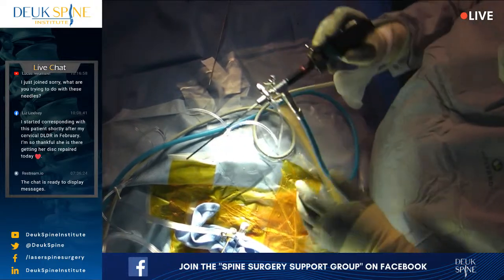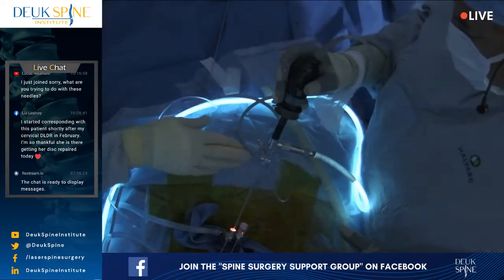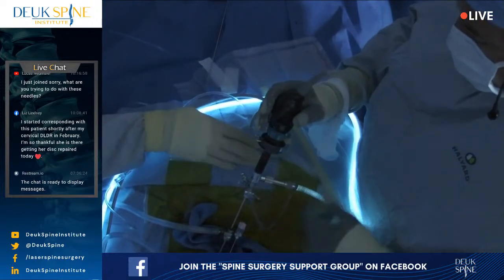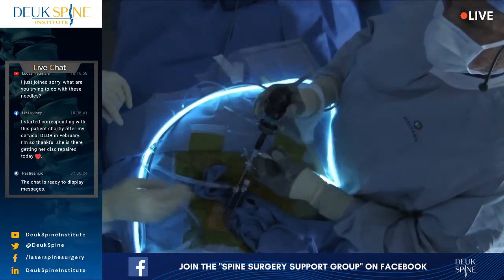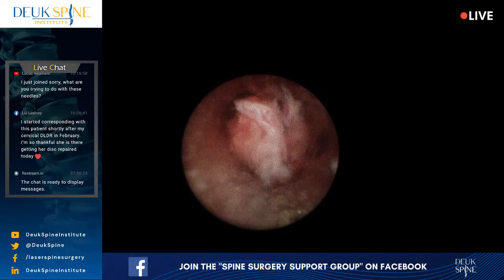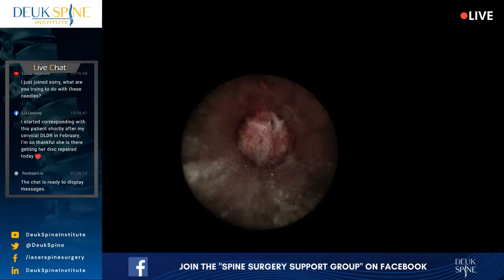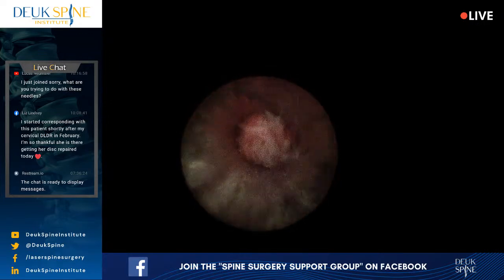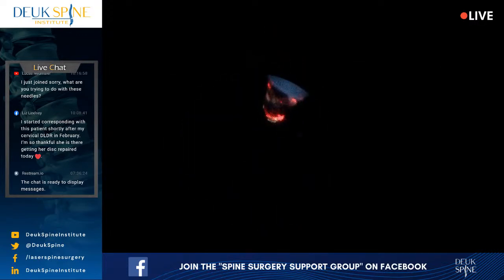All right, so here we go. This is called a single port or uniport. This is what, I hate to say it this way, but real endoscopic spine surgeons do: single port endoscopic surgery. There's a big push now for biportal because single port is too hard for most surgeons to do. They don't know how to do it. It's too complicated. So they're doing biportal, which I think is a cop-out. And you have to have 2 incisions, and it's not as good.